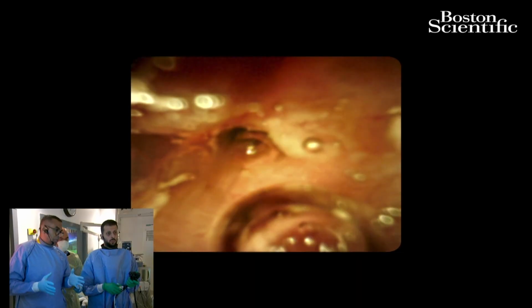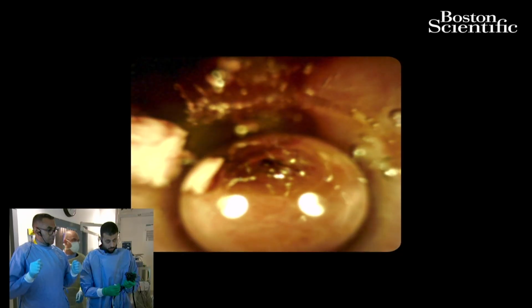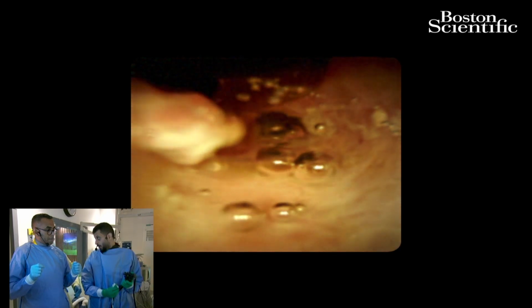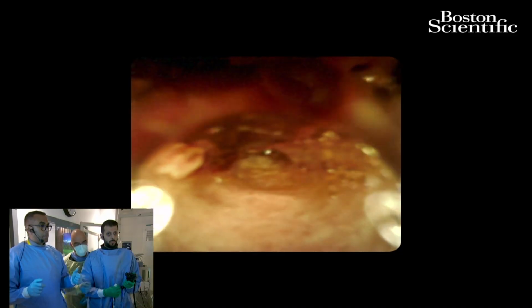So, but Ahmad, since we have that case, yeah, right now, yes. So I would agree. Just in case, he's probably 58 or 60 years old, and his cholecystectomy was like 25 years ago. Sometimes you wouldn't like to miss any malignancy.